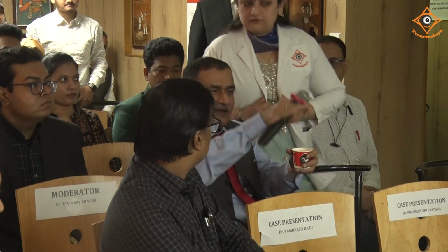Is the opening always by peritomy or a transconjunctival suture? Not really. If you can see the scleral flap tenting like this, you have to open and suture it. The problem is that bleeding is a big problem and it is difficult, that's why I said you don't want to do that. But if it's opening like this, then tomorrow also it's going to be like that only. It is not going to heal.